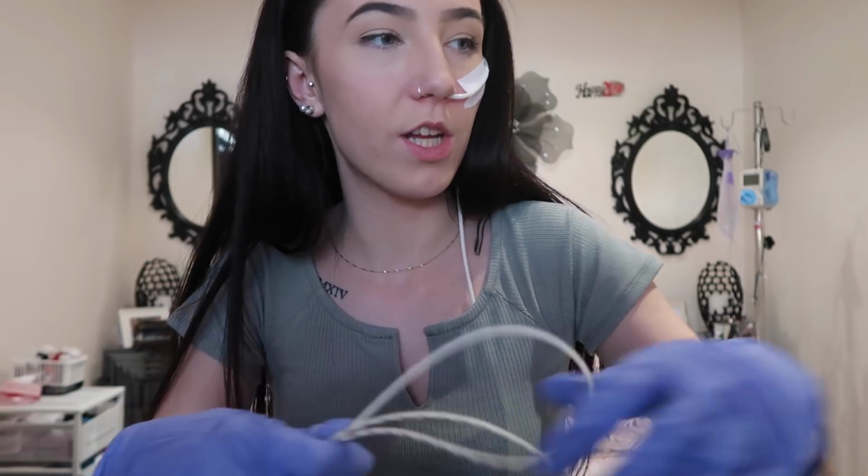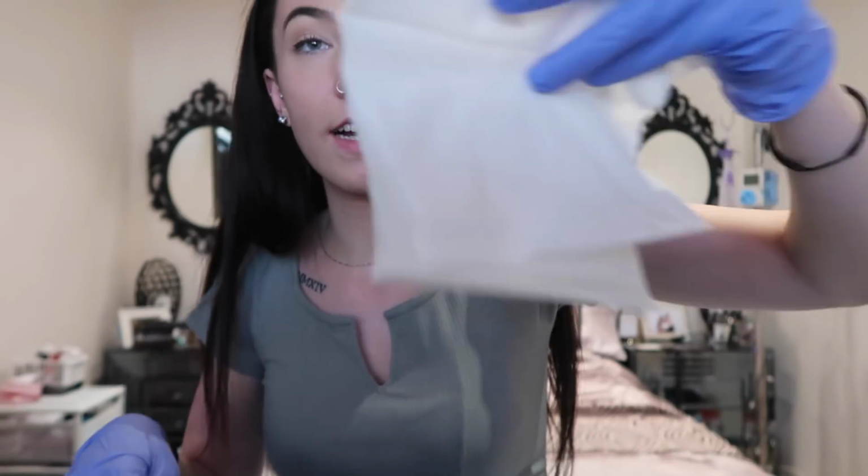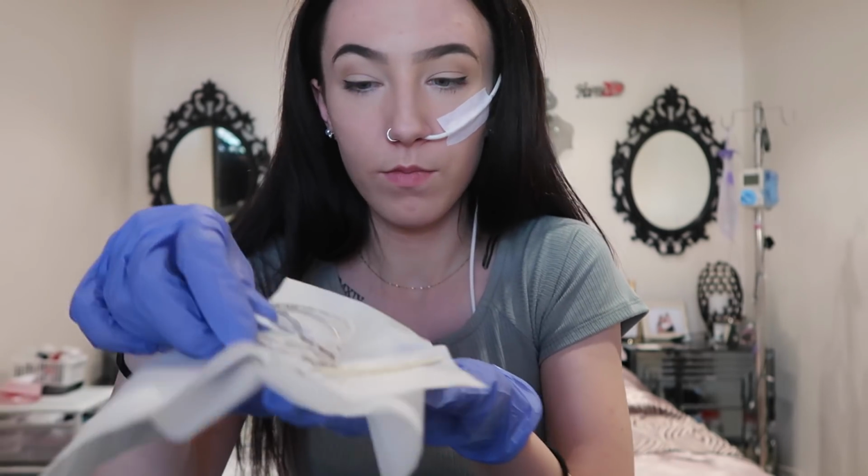Now I'm just going to grab a couple more tissues, because like I said, I want to try and keep this tube as clean as I can, even though I know it's just come out from inside me. I don't want to just leave it resting on the side. So I'm just going to wrap it with some tissue like that. I'm just going to leave it like that just for a second. Now I'm going to take off my gloves because I don't really need them on now. It was just more about getting stuff on my hands.